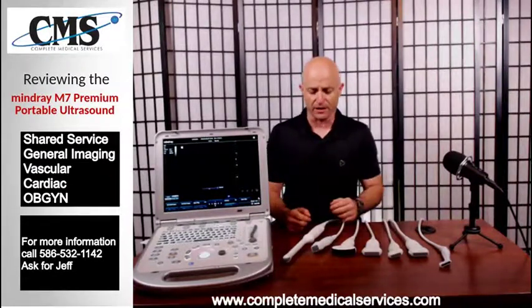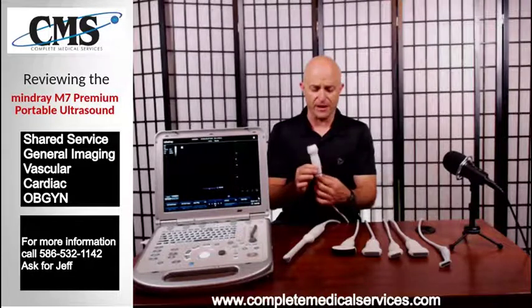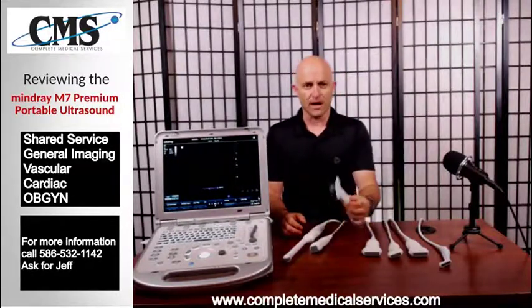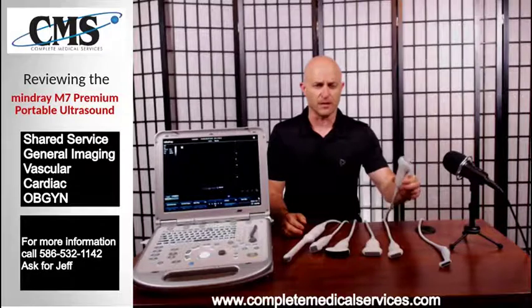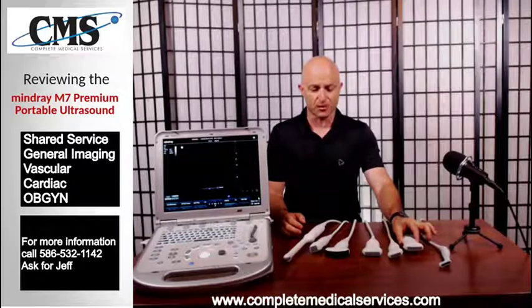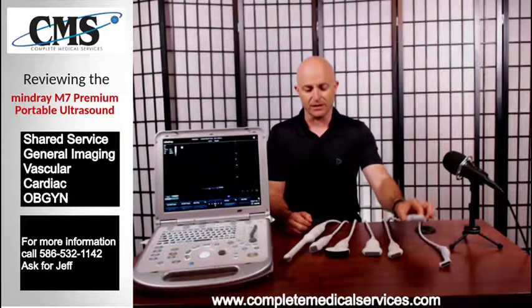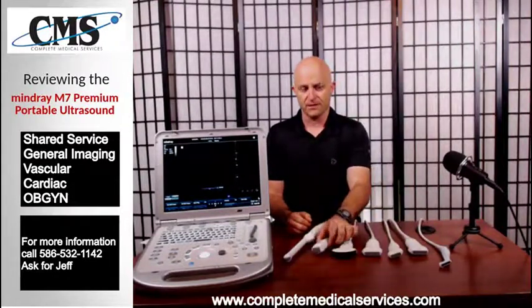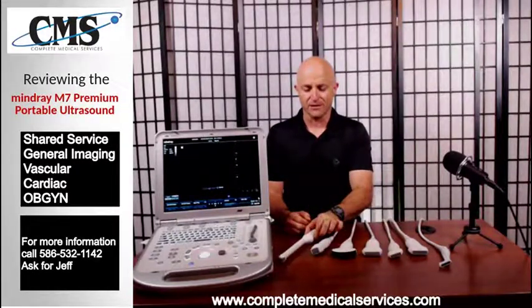What does shared service look like when we're looking at our transducers? We'll start with the cardiac transducer — the phased array — our convex for abdominal, and then one of the linears. A good standard option for the linear could be the L12-4S or the L14-6NS. So that would be a 3 or 4 probe configuration: a linear, a convex, a phased array, and optionally an endocavity. In most cases the endocavity is optional and typically is not selected.